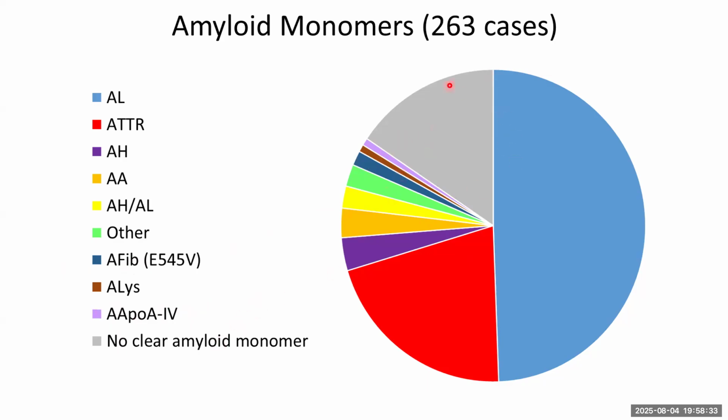But we've also got cases where we aren't getting something that we consider definitive enough. Other groups overseas might be quite happy to look at just the intensity of certain proteins in the biopsy. But we feel cautious about calling that without the additional backup of seeing those aberrant cleavages in the matches. Maybe we're cautious, but we're also not in control of how much material is presented to us or how much amyloid is present in that material.